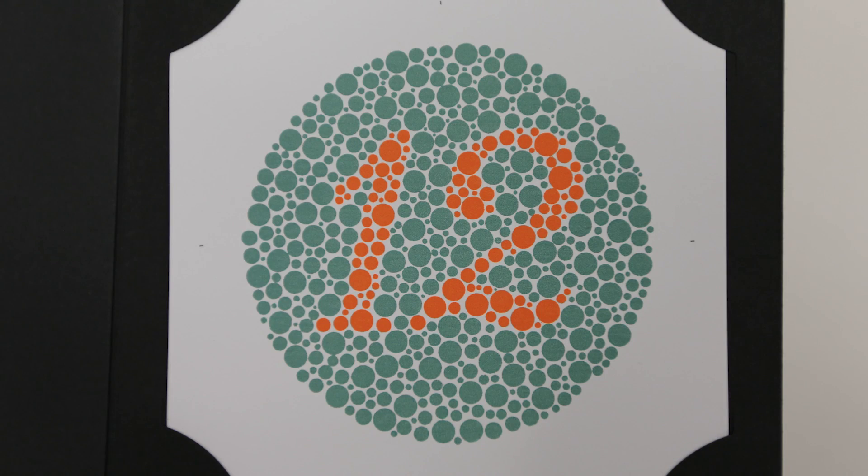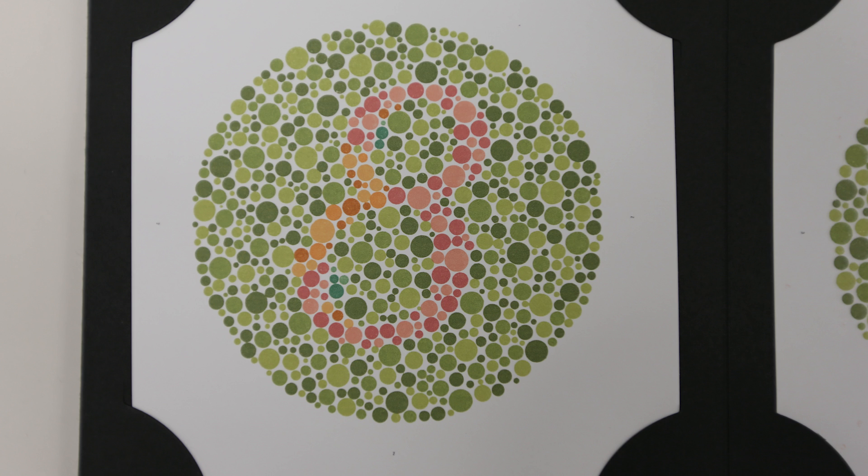Plate number 1 should be read by both normal vision and people with color vision deficits in exactly the same way — both should see the number 12 on this plate. Now, numbers 2 through to 7 are transformation plates, so colorblind people will see a different number than what people with normal vision will see. In this example we're looking at plate number 2 — people with normal vision should see one number, but people with red-green colorblindness will see a different number.